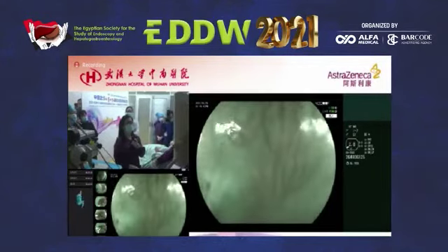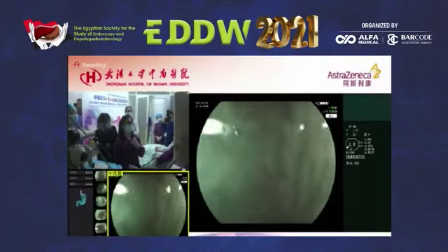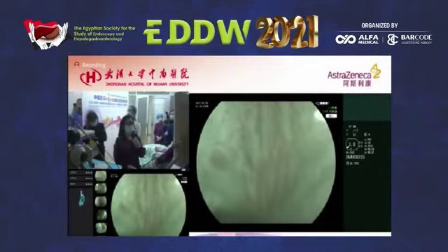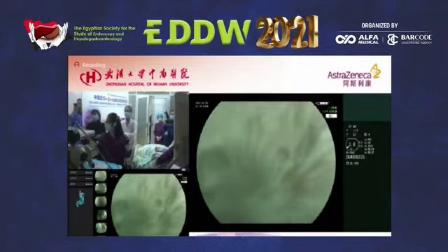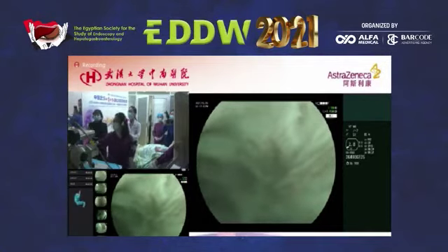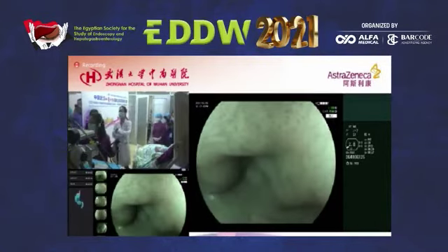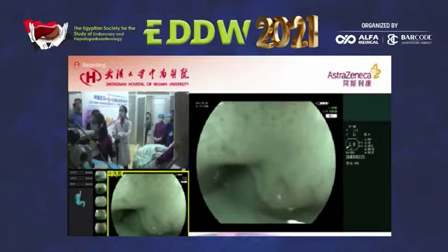Excuse me. Yes. As far as I understand, you use a computer to diagnose what you see. Am I right? Are you using that AI as an assistant? Yes. Look at this AI system produced by Hellan Xuanwei medicine information technology company.